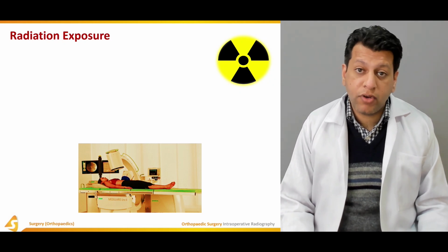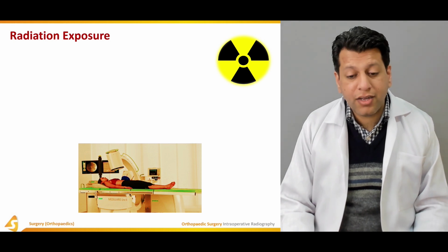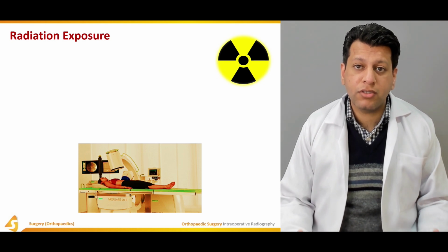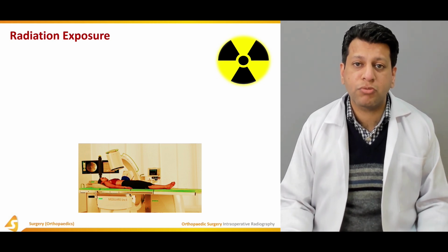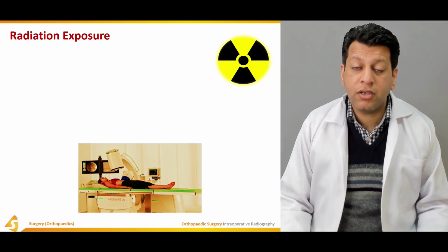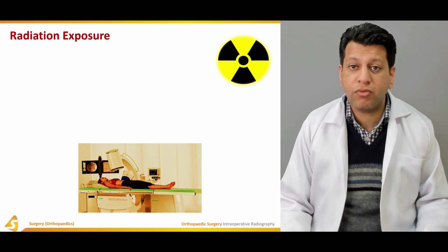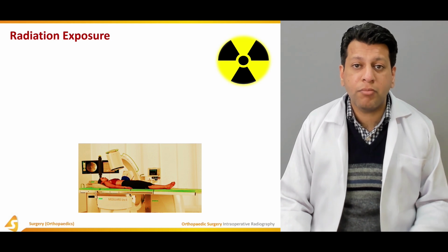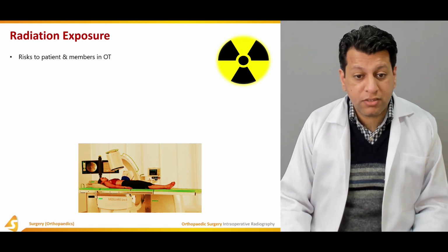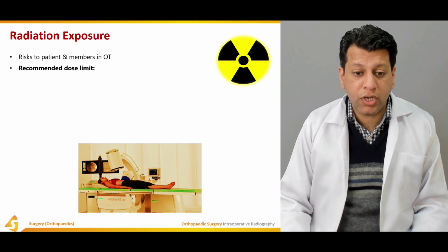Then again, with every positive, there are always negatives. There are always pros and cons of everything, and unfortunately, the staff, working doctors, nurses, and paramedics are always exposed to radiation, especially in the case of an orthopedic surgeon, because in orthopedic surgery intraoperative radiography is frequently utilized, especially fluoroscopy, which is done very commonly. Therefore, all the staff is exposed to an increased amount of radiation. There is always risk to the patient, but the most risk is to members in the OT.